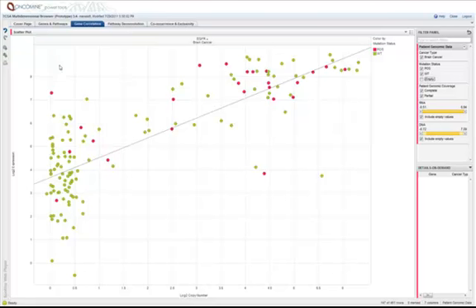But what's most fascinating by this data is the co-occurrence of mutations with amplification and overexpression. I might have predicted, not having looked at the data, that most of the mutations would be confined to the copy number neutral cases as an alternative mechanism to activate EGFR. But instead what we see, these cases are amplifying and overexpressing and mutating the EGFR protein, pointing to multiple selective hits on this same protein and its importance in cancer.